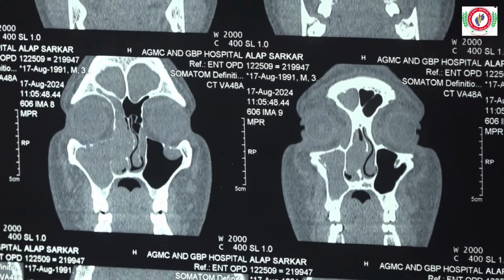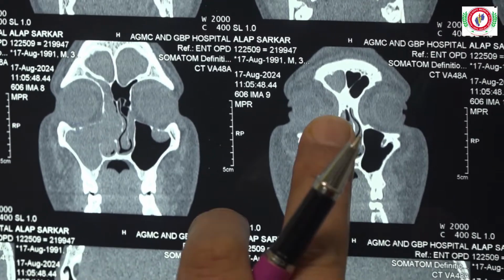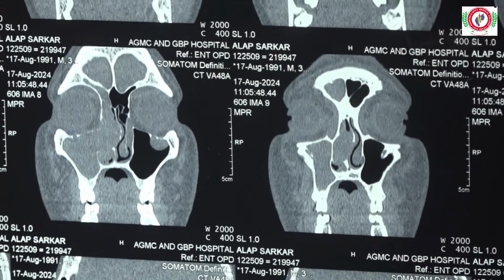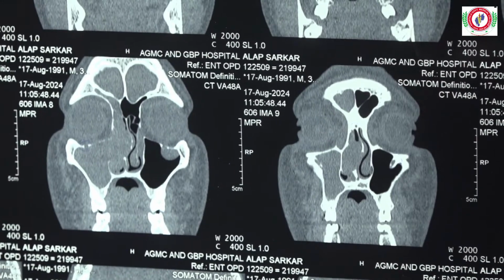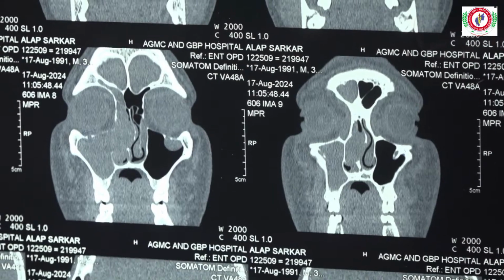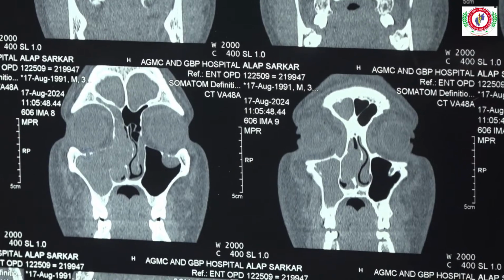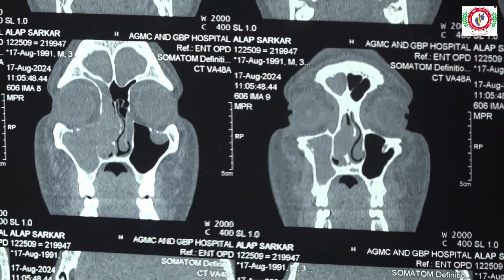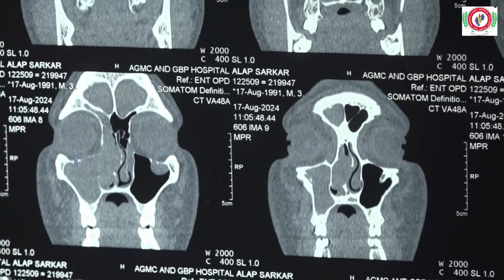Now in this part you see the frontal sinuses above and this thick bone below. This is the frontal beak. Rajiv, regarding that frontal sinus, how would you differentiate between a mass and retention of secretion because of blocked frontal drainage? Actually we cannot distinguish it on CT. We can distinguish it on contrast. If there is a mass, it may enhance on contrast, and if it is simple secretions, it will not enhance.